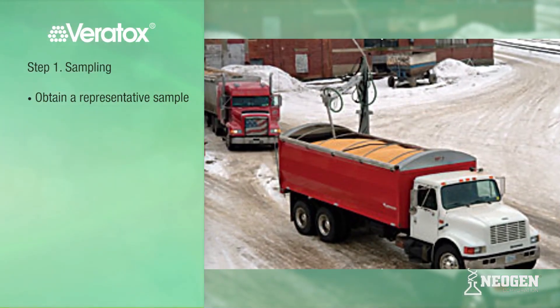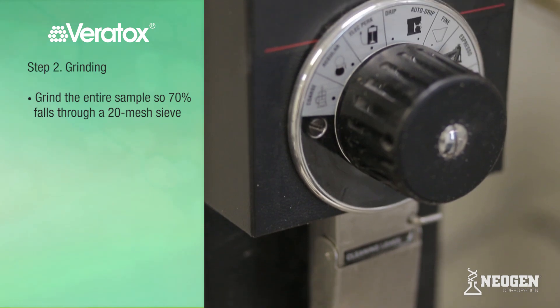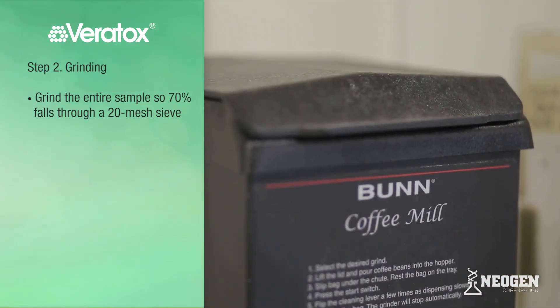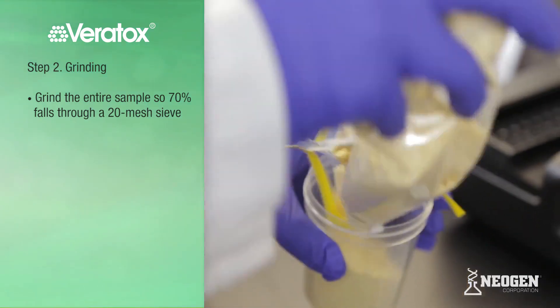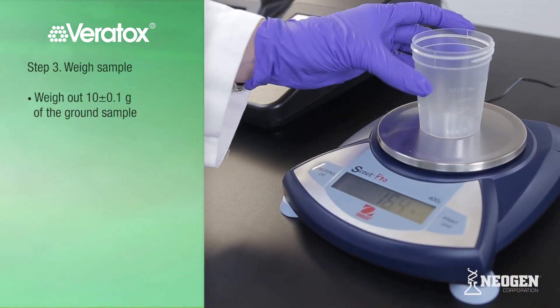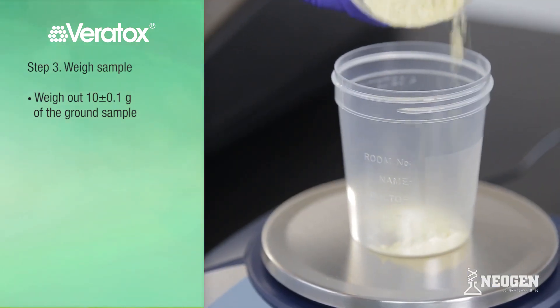A representative sample is very critical in evaluating the level of toxins in your entire commodity load. Grind the entire sample using a bun grinder or equivalent so that 70% falls through a 20-mesh sieve — about the consistency of finely ground coffee. Place an extraction cup on the scale and zero out the scale, then weigh out 10 grams, plus or minus one-tenth of a gram, of ground sample.